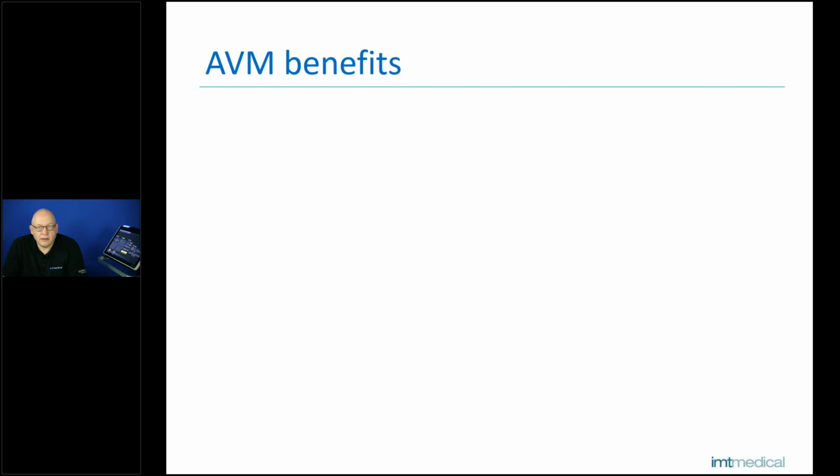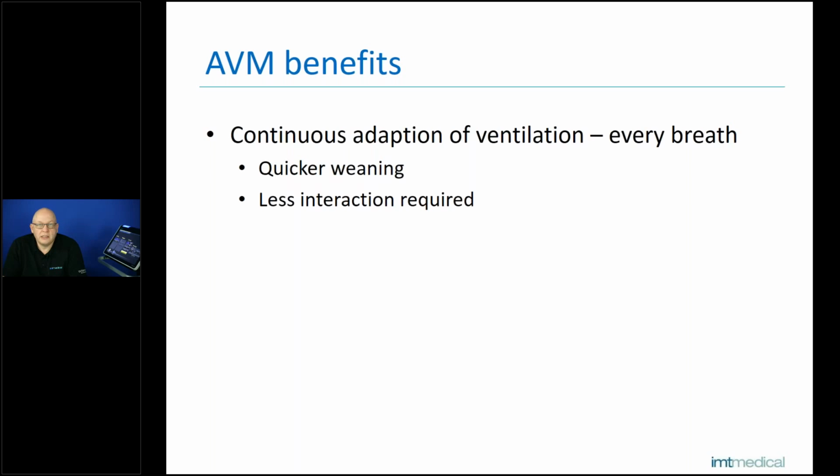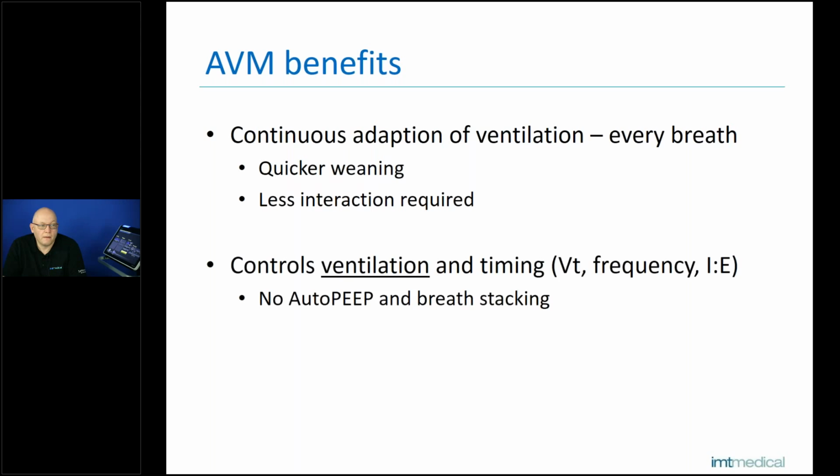The benefits of AVM are short. We have a continuous adaptation of ventilation, so the patient is always observed by the ventilator. This results in quicker weaning, and also you have less interaction, you have less manipulation.